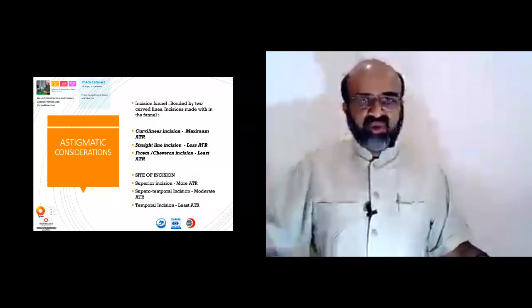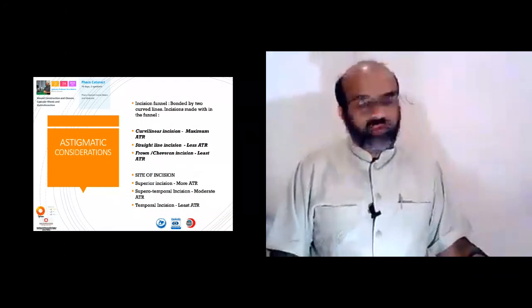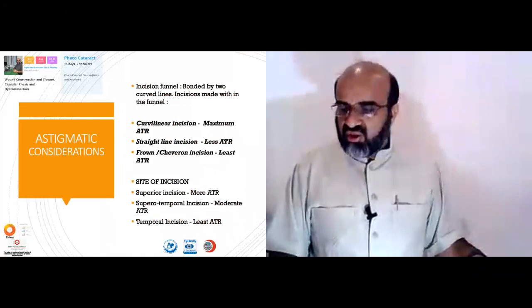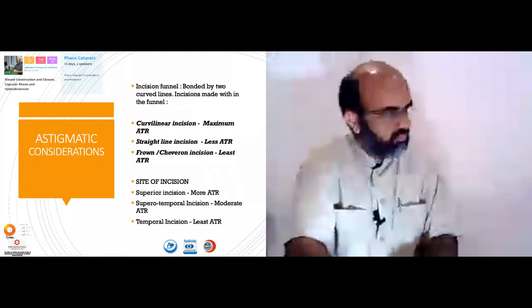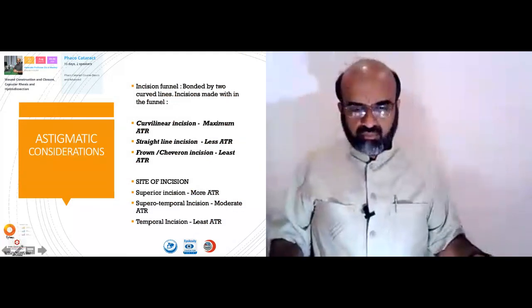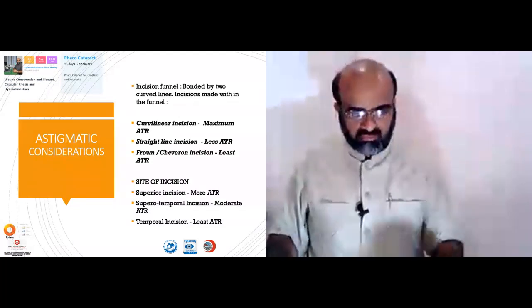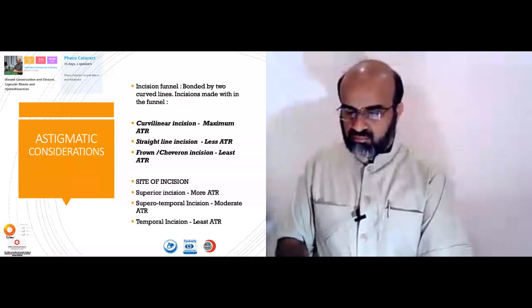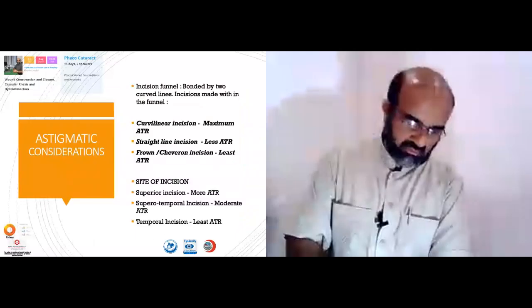And regarding surgeon-induced errors, in our previous discussion there was a lot of stress and clear guidelines about construction and minimization of surgeon-induced errors. So this was about astigmatic considerations.